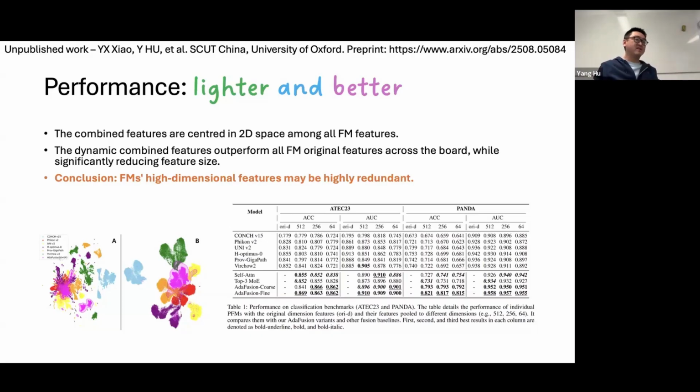When they talked with the clinicians, the clinicians told them, "You give us a very efficient, very quick model. That's good, but the thing we care about most is still that the accuracy needs to be improved.